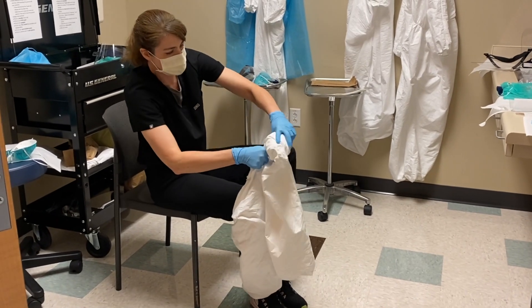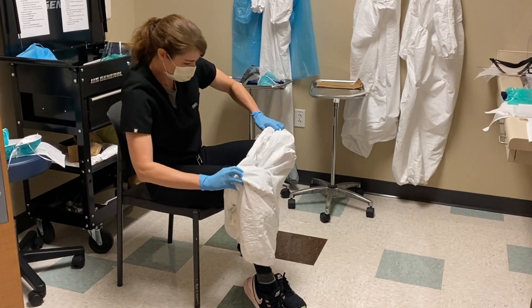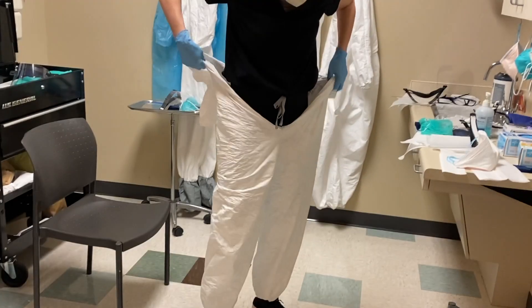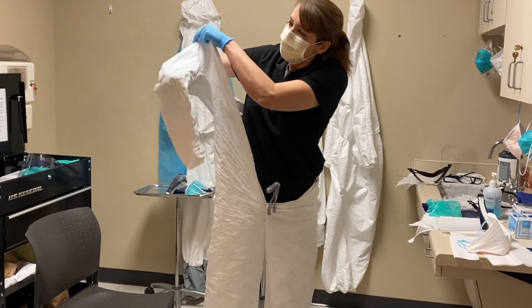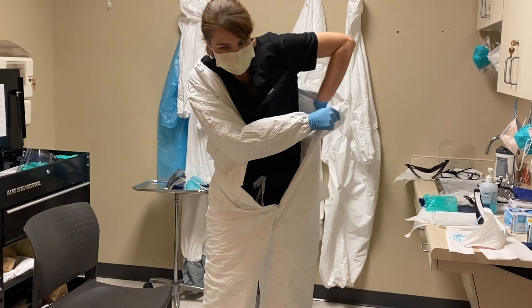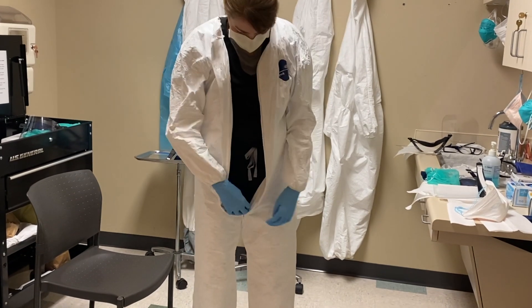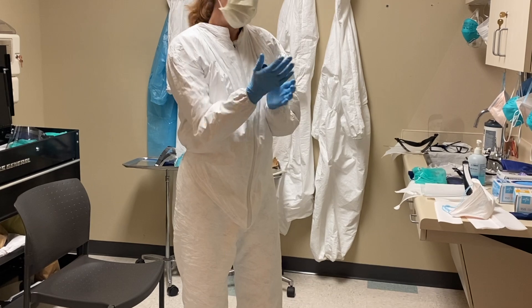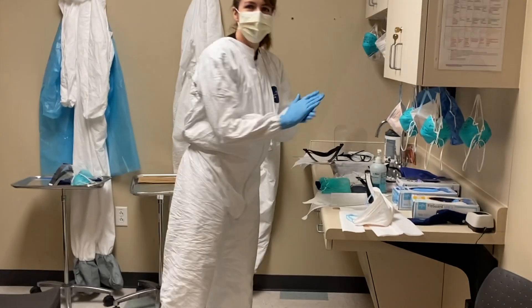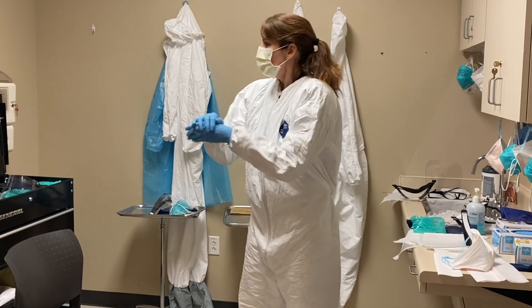Put one side on, put the other side on. This really is the base layer for a majority of PPE. Some Tyvek suits have footies that protect your shoes, but we don't have those anymore, so now we have the footless ones, which are fine. Zip that up. Between every step I sanitize, because you just never know what's lingering on the Tyvek suit.